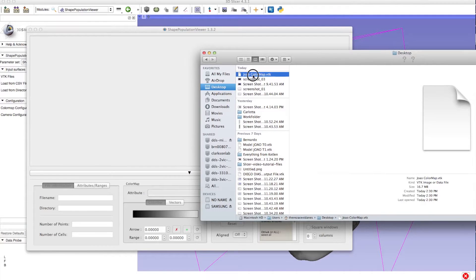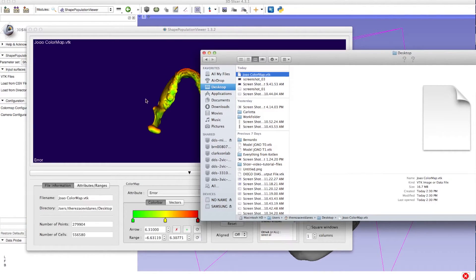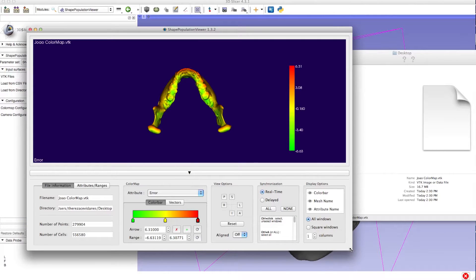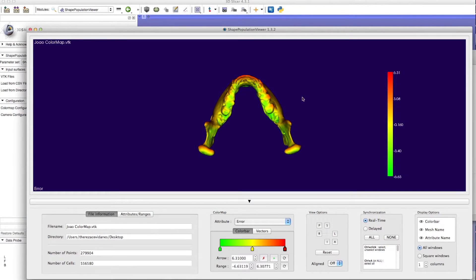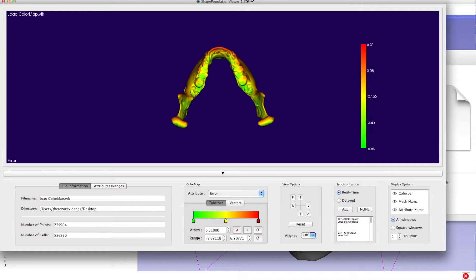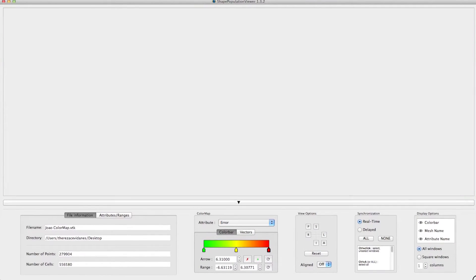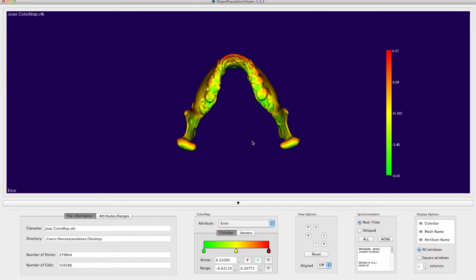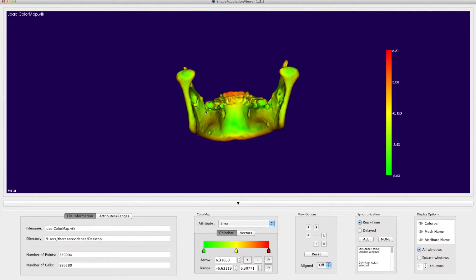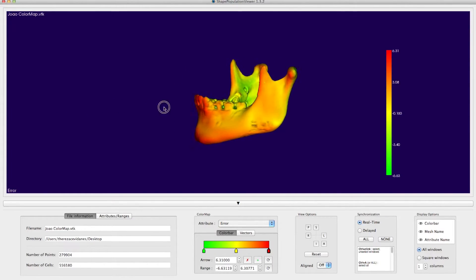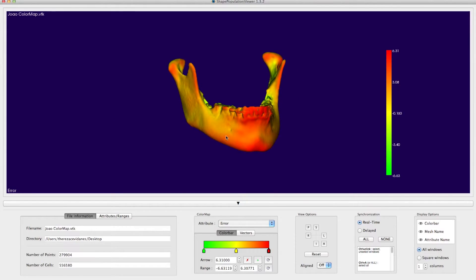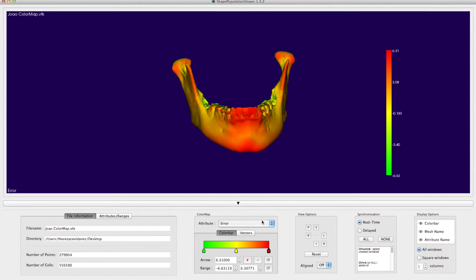Drag and drop the color map file into this window. From this window, it is possible to change the range, add arrows with new colors, change the background color, and change the text color. This tutorial runs through a few of them. When you change the range, it's possible to analyze the movement in specific regions.